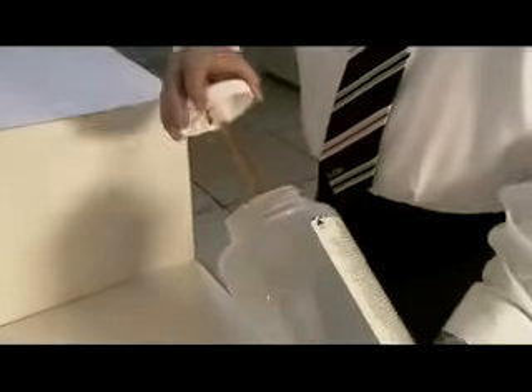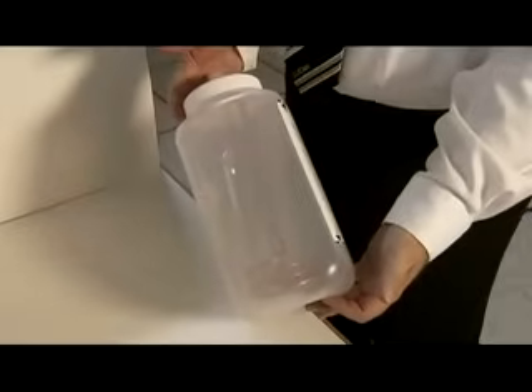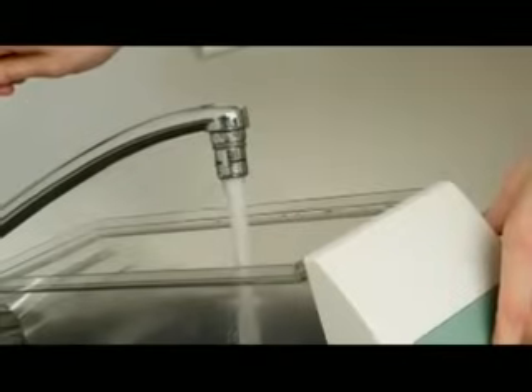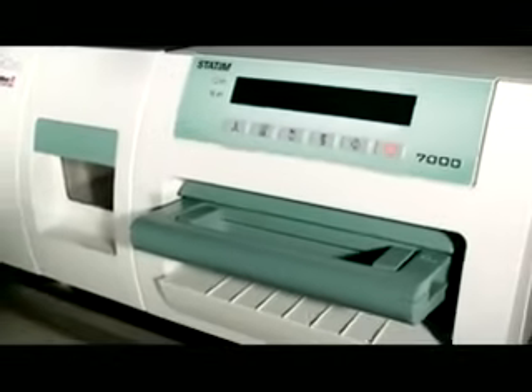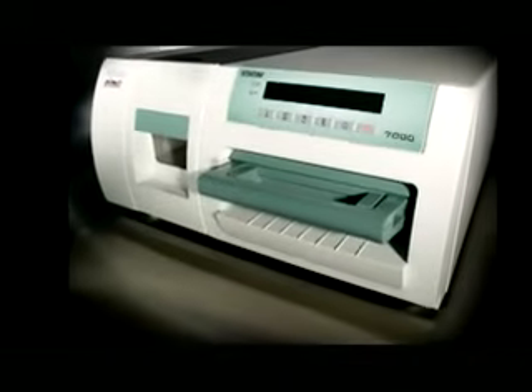Unlike other autoclaves that vent waste into the fresh water chamber, all Statum sterilizers vent into a waste bottle. What that means for the dental practice is fresh water for each cycle, giving you better processing and less maintenance time. This is the chamber alternative for pouches of all types. Seals and filters talk to the Statum 7000 and prompt the office to change them out in a scheduled manner. And the ability to use tap water instead of steam distilled identifies the 7000 as a unique sterilizer. Dental practices can now enjoy all the advantages of a chamber autoclave combined with the next generation Statum technology.